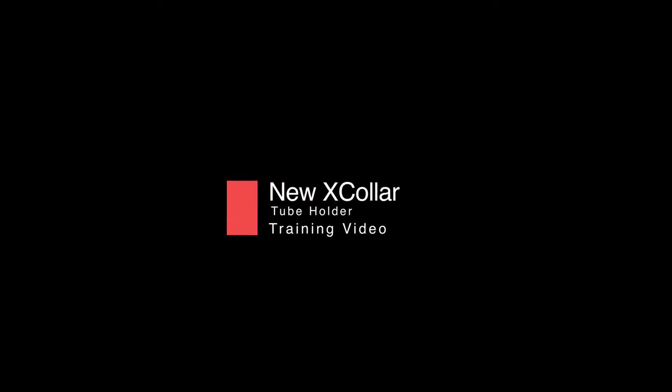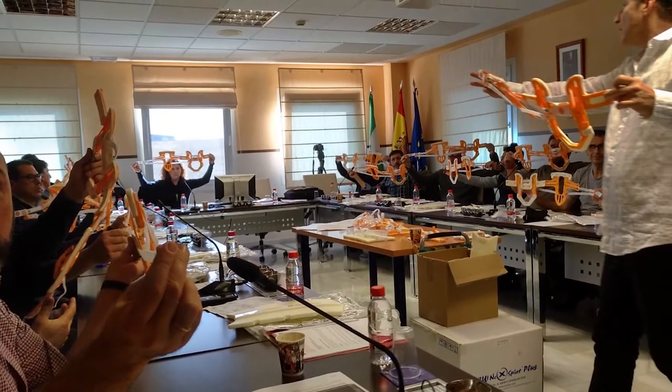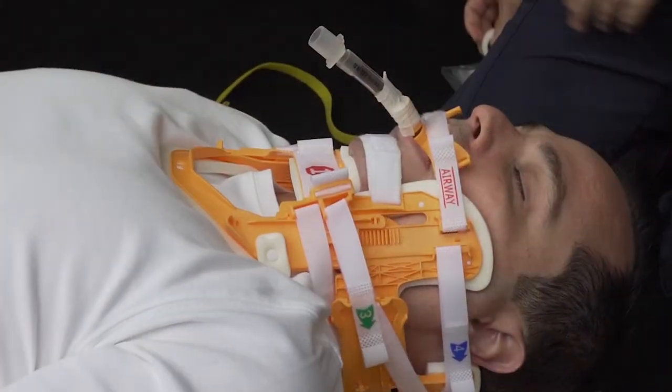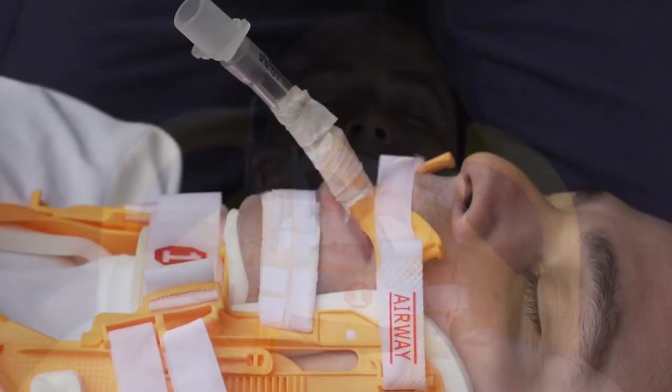New X-Color tube holder. Following the advice of EMS providers, we have improved on the way to secure endotracheal tubes, making the application completely anterior, thus avoiding placing pressure on neck veins or arteries while ensuring the best possible oxygen delivery to the brain.